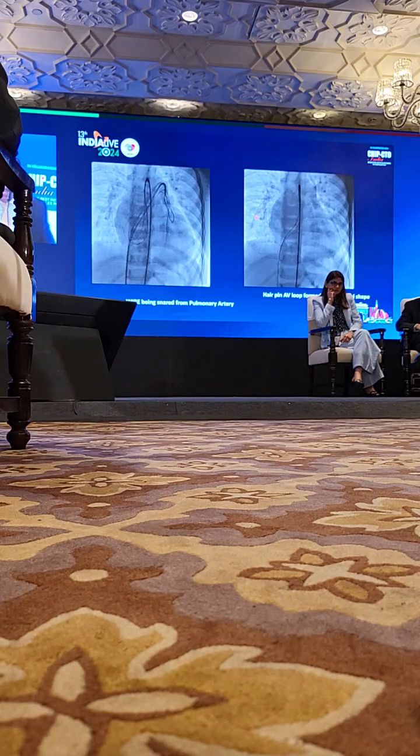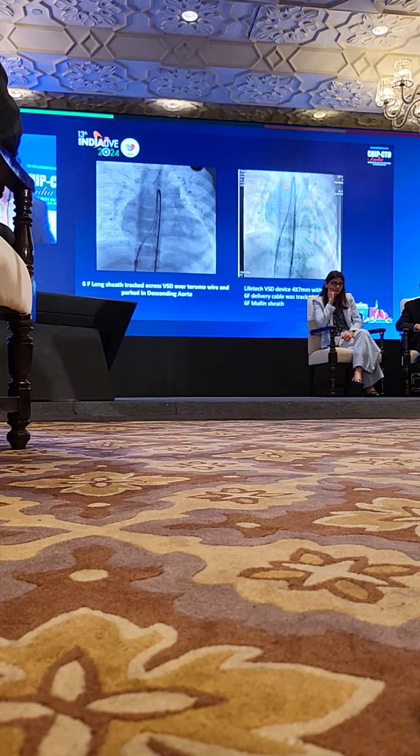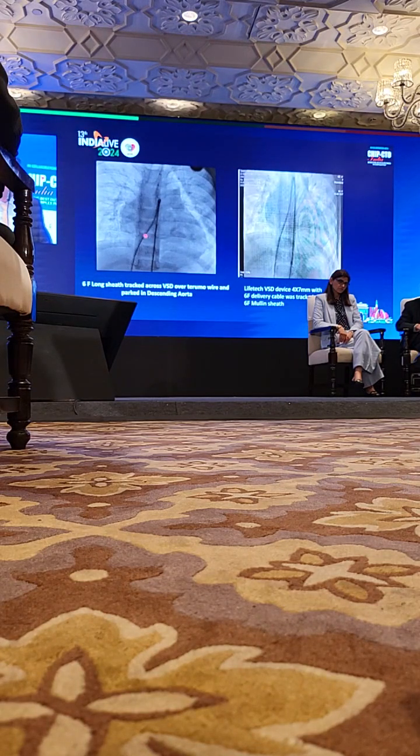So what I did was I pulled back the wire up to the VSD level, and I again crossed, again parked it in the pulmonary artery, and again subsequently snared it. So here we can see that the hairpin loop was better, and now over it I am tracking the 6 French long sheath, Mullins sheath, along the terumo wire which has formed an AV loop. Here we can see the next difficulty will be when the 7 French or the 6 French long sheath crosses the VSD. There may be resistance during this stage.